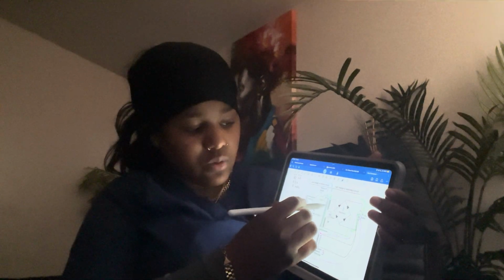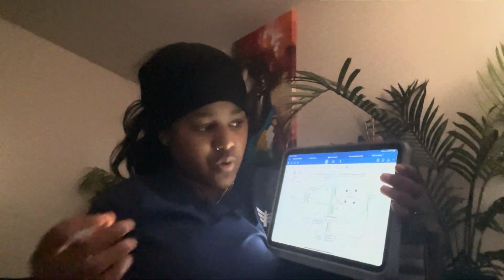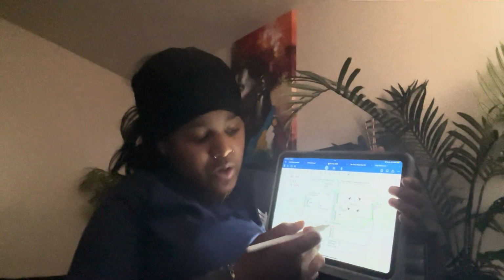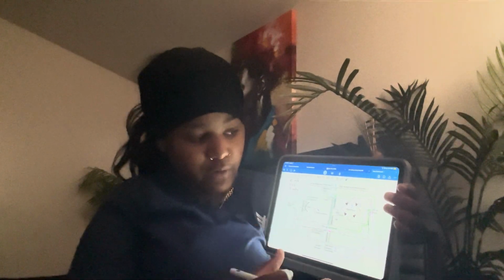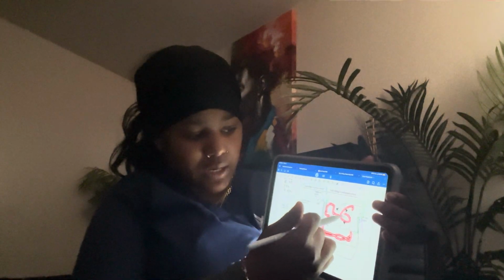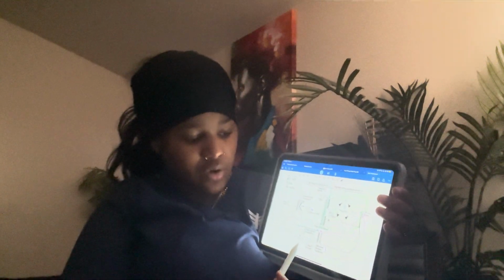And when we are stepping up that transformer, we are stepping up from low voltage to high voltage. So we are completely changing the current flow and how it's alternating through the current to process through the secondary. Now, we will get into more detail about the step up transformer after we touch more base on the filament.